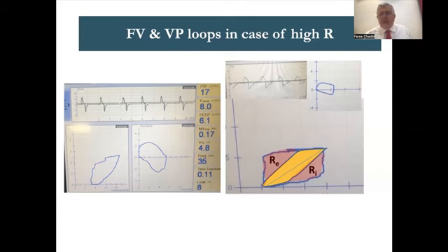So I hooked the patient on the ventilator. I got that graph. It's a graph of very high resistance. Since he was having a bit of cough and wanting the tube out, I just took that tube out, and the patient took a deep breath and went all right, because that was his graph of high resistance.